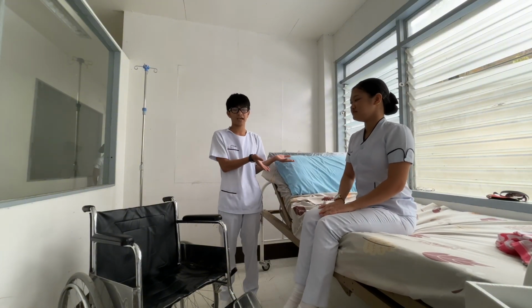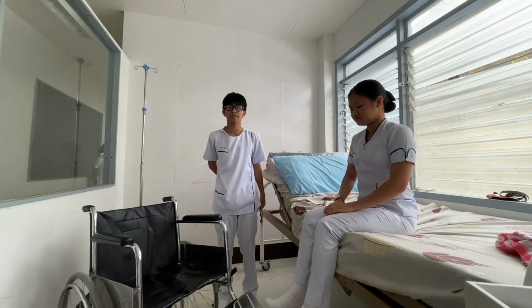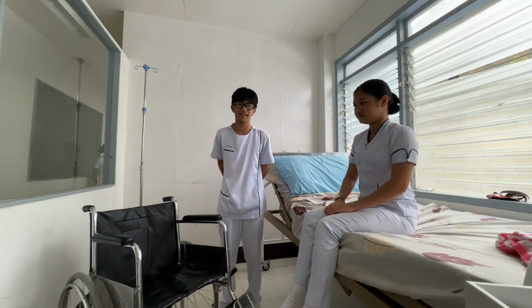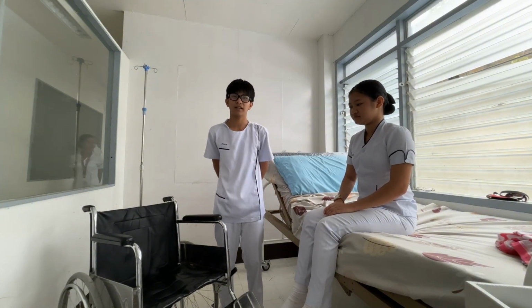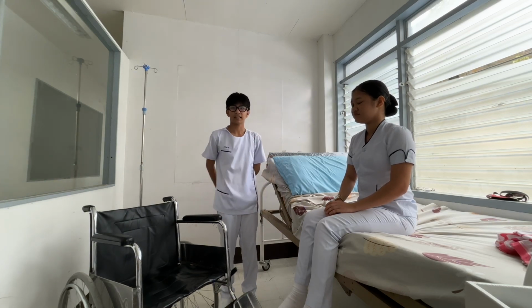Assuming that the client has already dangled her feet a few minutes ago, assist the patient to put on a robe or non-skid footwear. So, assuming that we have already put the non-skid footwear and robe on the client, let us now proceed.